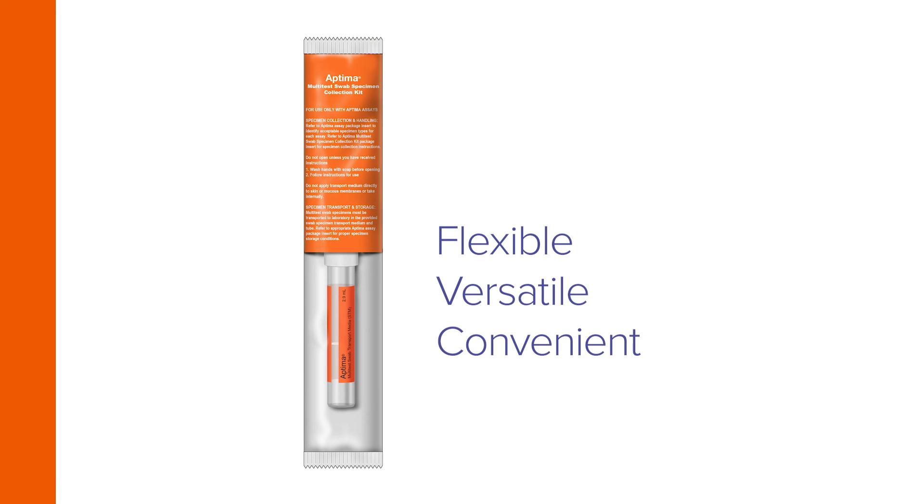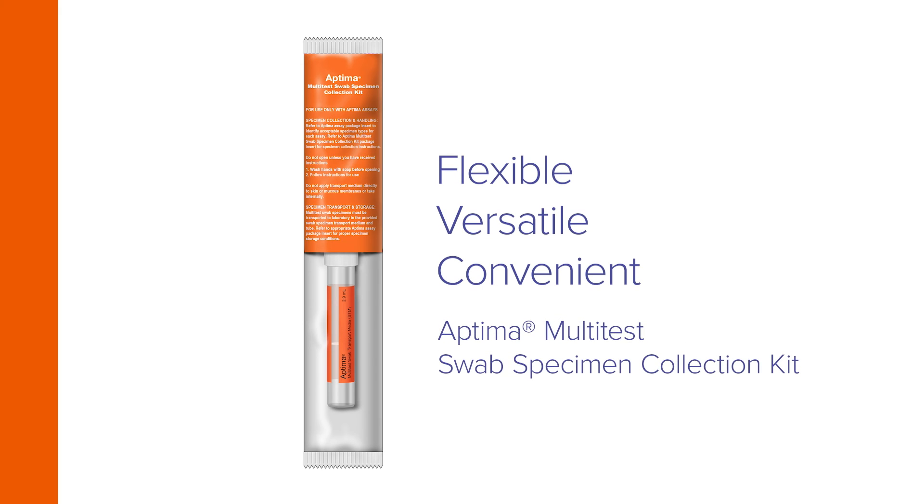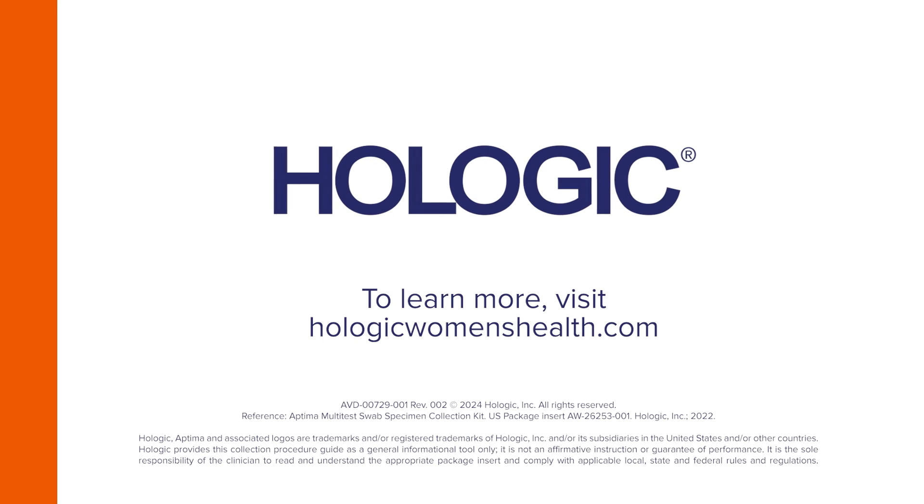Flexible, versatile, and convenient throat specimen collection by clinicians with the Aptima Multi-Test Swab Specimen Collection Kit. To learn more, visit HologicWomensHealth.com.